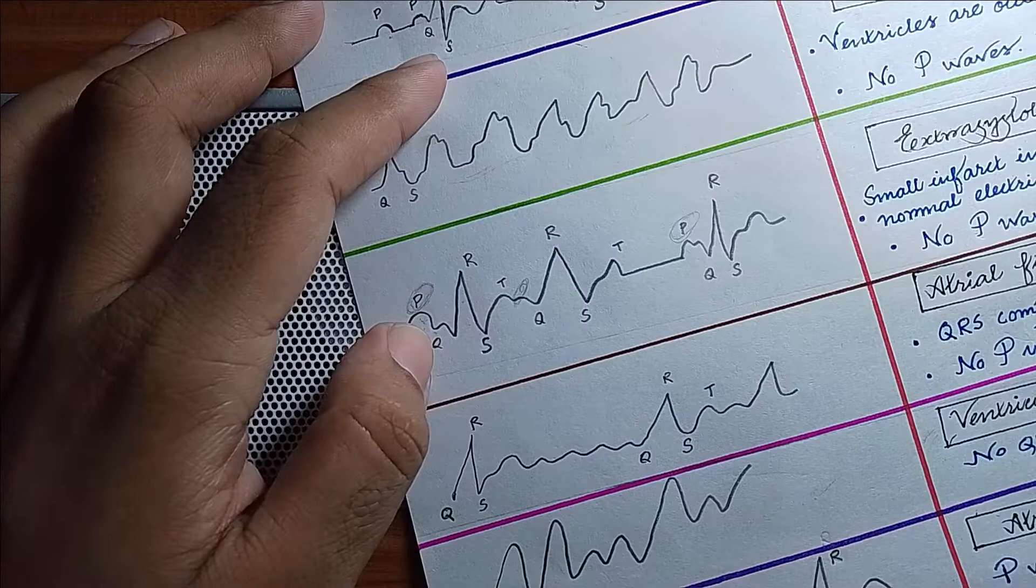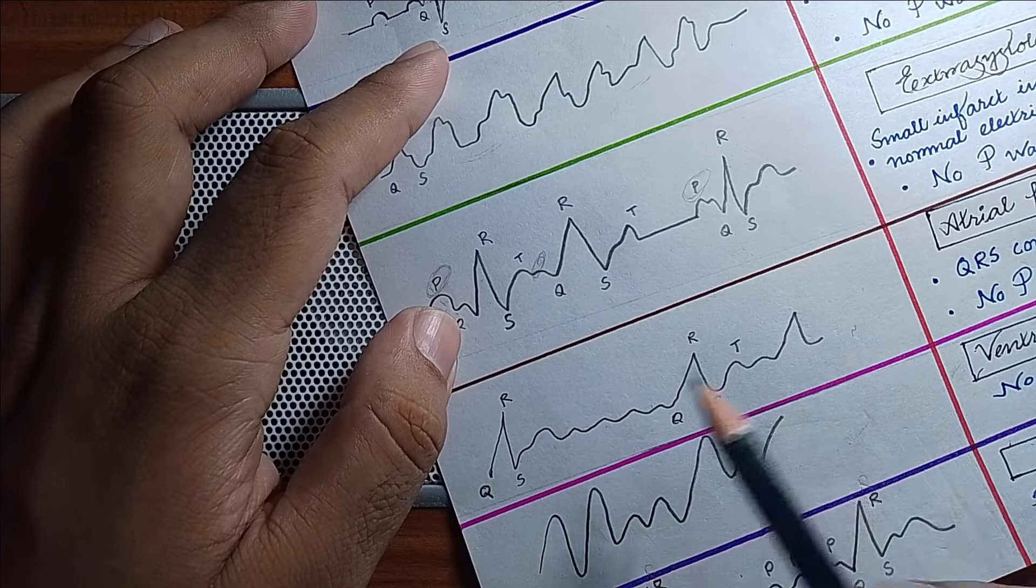In the next ECG you can see there are again no P waves and the QRS complex is also irregular, right? So the most likely diagnosis is atrial fibrillation.